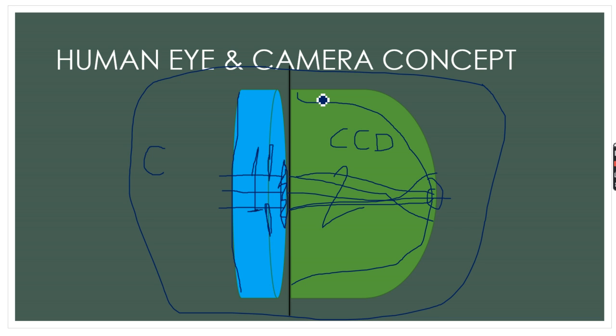Agree? Yes, I know you're answering yes. So the perception of light is preserved even if we take out everything up to the lens part. Why? Because the retina is healthy. So here the same thing applies to the CCD. Even if we detach the coupler from the CCD and just focus it over the front area, the CCD will perceive the light, but there will be no image on the monitor, right?